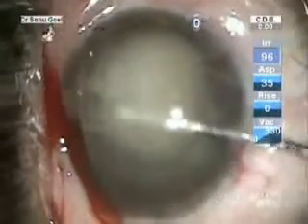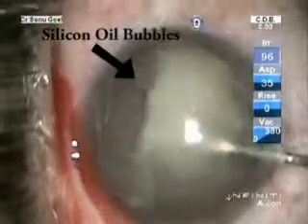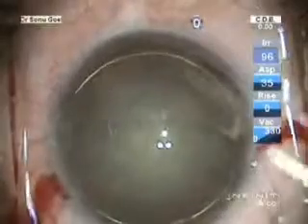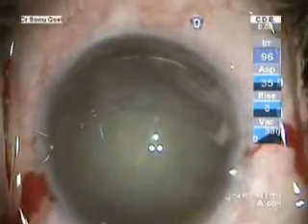Yet this is another case of a vitrectomized eye with silicone oil and secondary cataract. We go in, push in viscoelastic, drain out the silicone oil in the anterior chamber and try to accomplish a good rhexis. We initiate our rhexis, make a 2.5 main port entry, and looking at the weak zonules, we push in a capsular tension ring to support the weakened zonules.